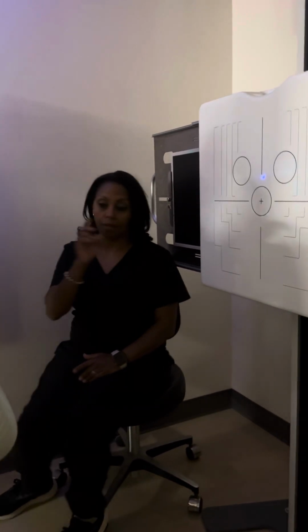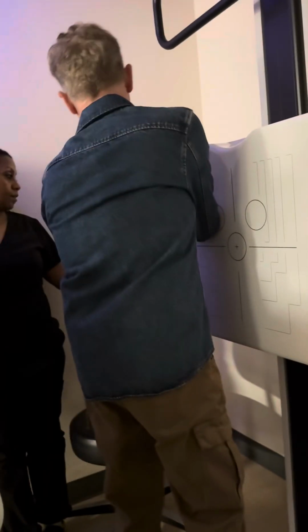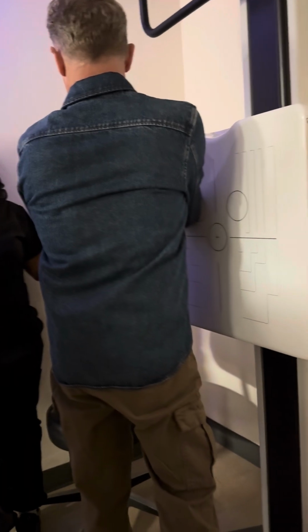Any questions on that? So tape the IR to the Bucky. How come we're not using the wall Bucky instead? When we don't need a grid? We only use a grid when we're over 9 centimeters.